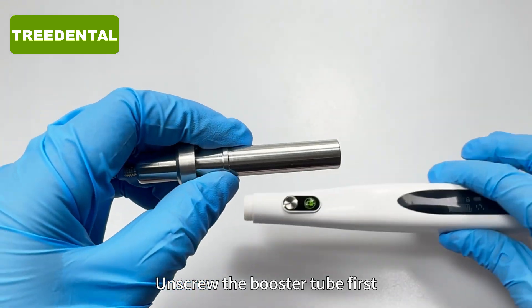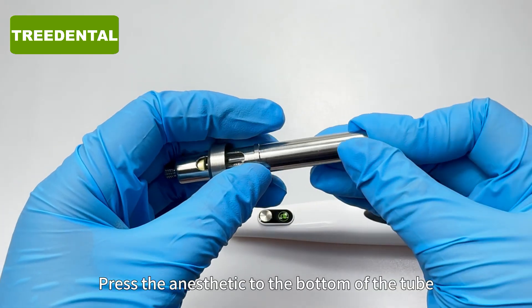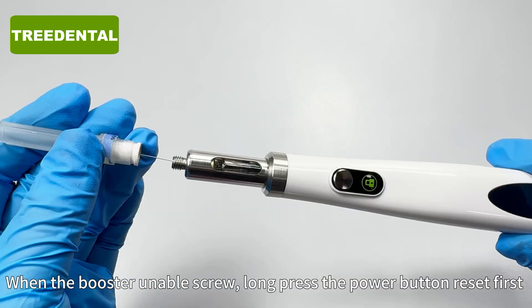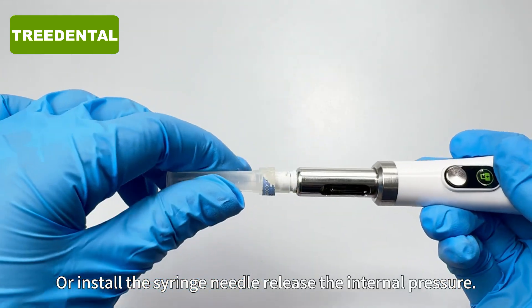Unscrew the booster tube first. Press the anesthetic to the bottom of the tube. When the booster unable screw, long press the power button to reset first. Or install the syringe needle to release the internal pressure.